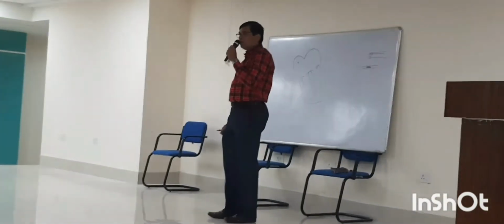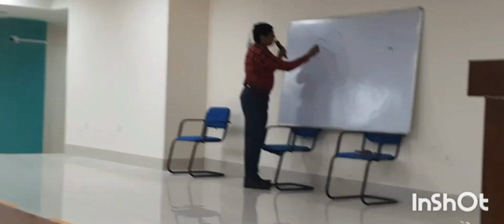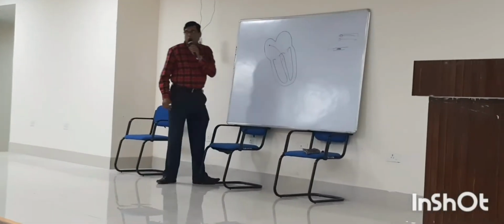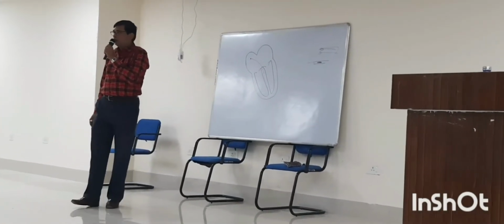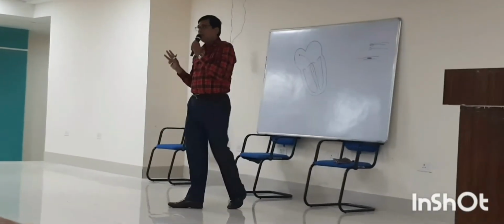First, the atrial depolarization vector. It moves from the SA node to the bundle of His, and it reaches the ventricle. Then there are three ventricular vectors.